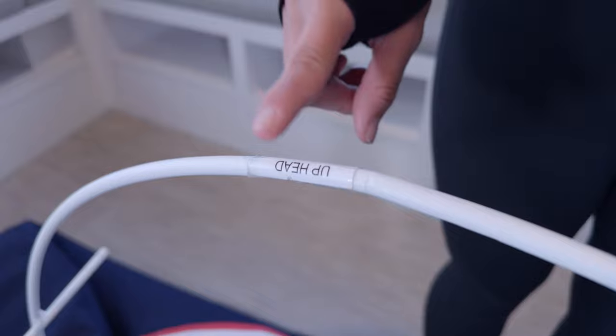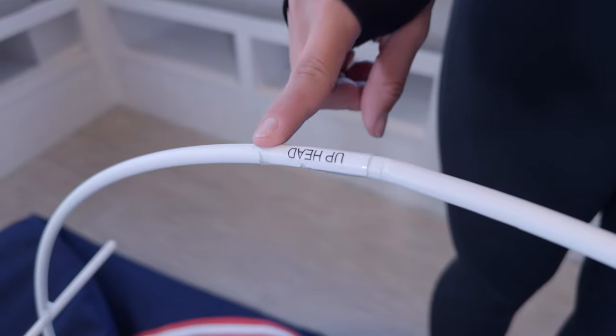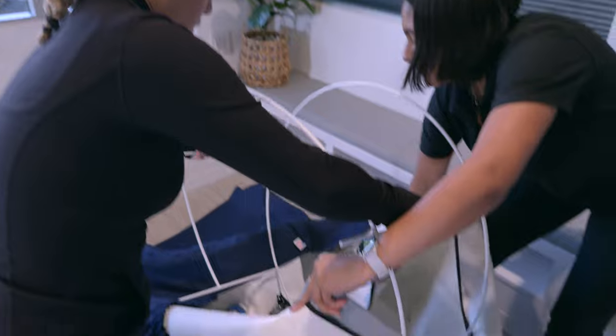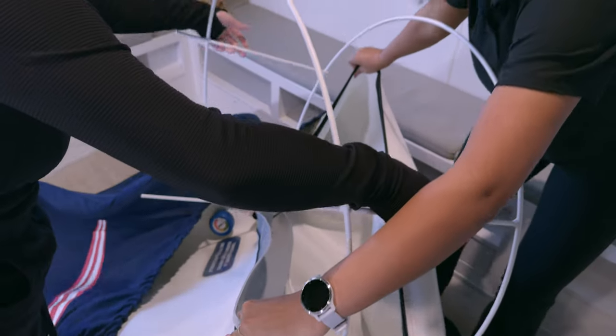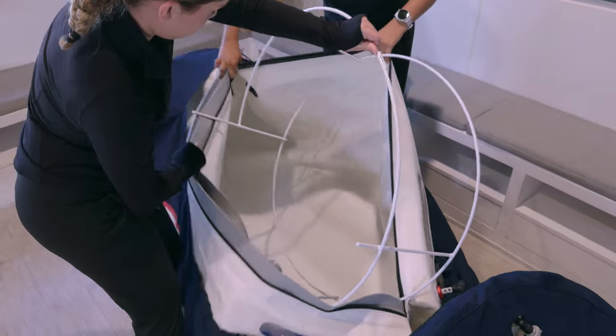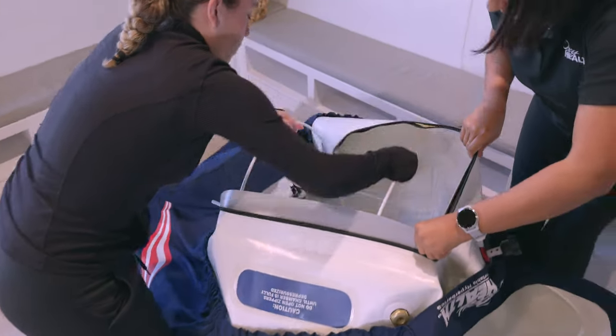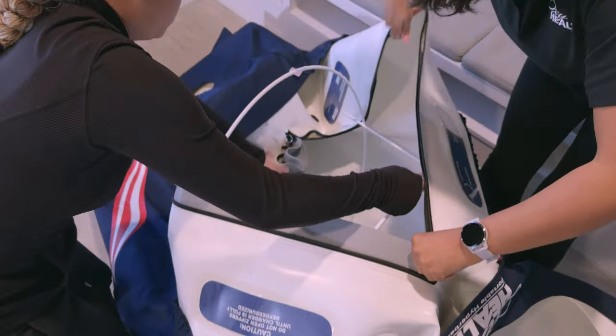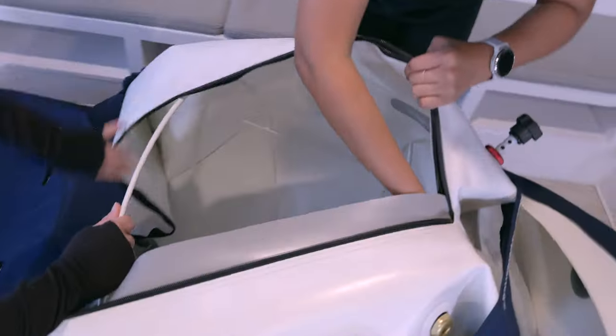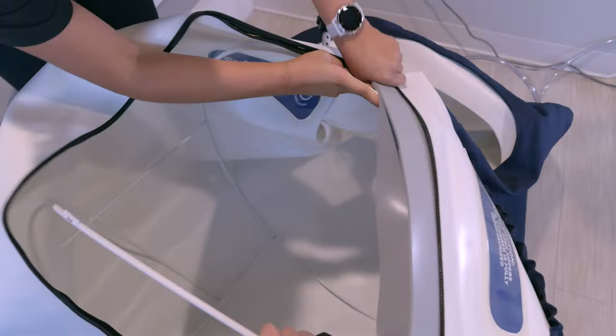Install the frame structure. Start with the head round frame with the up-head sticker side up. With assistance or alone, insert the frame sideways into the open zipper area. Pay careful attention to the opening and the sides of the chamber — it will take some maneuvering. Once past the zippers, pivot the frame with the head-up end toward the head of the chamber with the top window. Pay careful attention that the frame clears the valves.